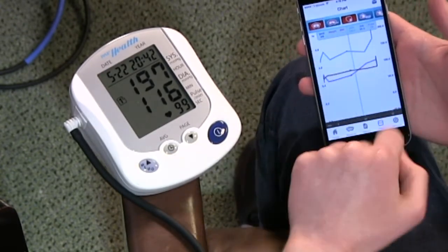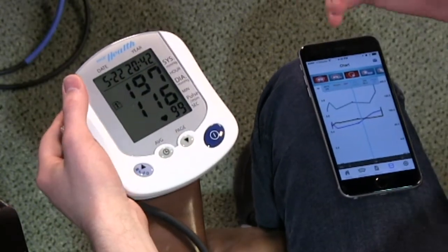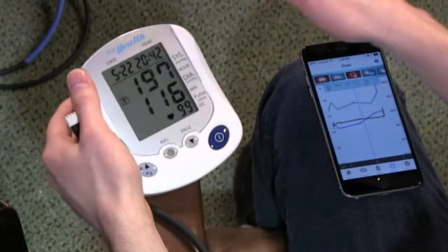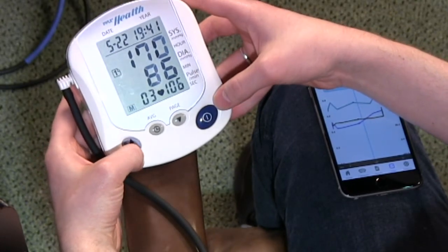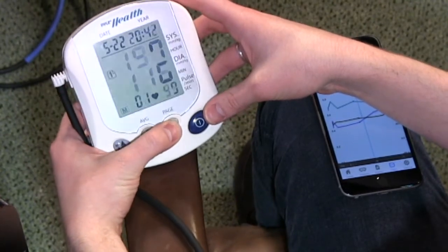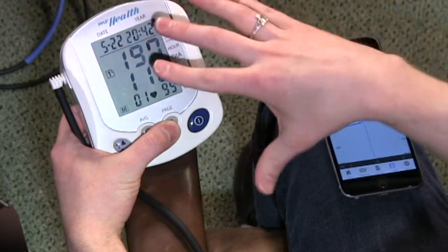So here's a graph of everything. What's nice is that they pair very well, and this will actually work completely on its own, so I can switch between. Oh, that's interesting. So you don't have to use the phone. You've got a readout. So can I switch between the things that users? It does this, but it has no display. Right. And as a result, you have to be tied to a device to do it. Right, so this will capture it.